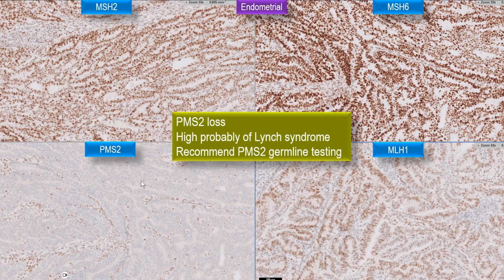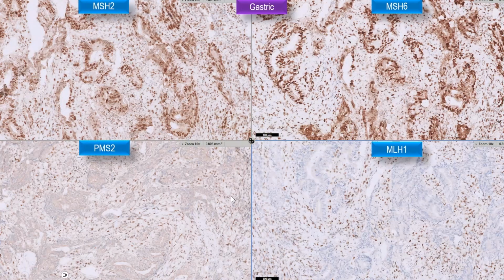So this one is a case of PMS2 loss. Again, you can recommend PMS2 germline testing, and good internal control.